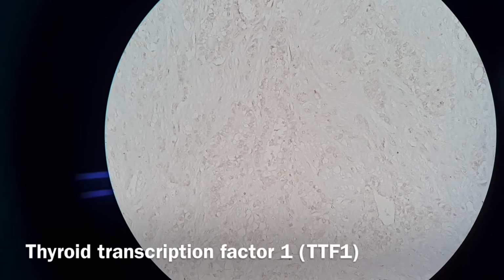And the last stain that we do is TTF1, the thyroid transcription factor 1, and this stain will help determine that it is directly from the thyroid. In this case, the stain is not that good. This is most probably due to overfixation of the tissue.